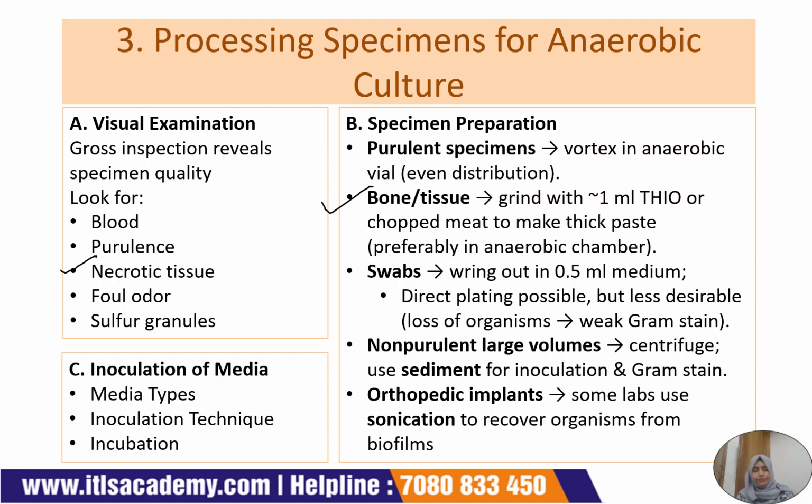But this is less desirable, because we have already discussed that there is loss of organisms and a weak gram stain. For non-purulent large volumes, we generally centrifuge and use the sediment for inoculation and gram stain. For orthopedic implants, some labs prefer sonication methods to recover the organisms from biofilms.